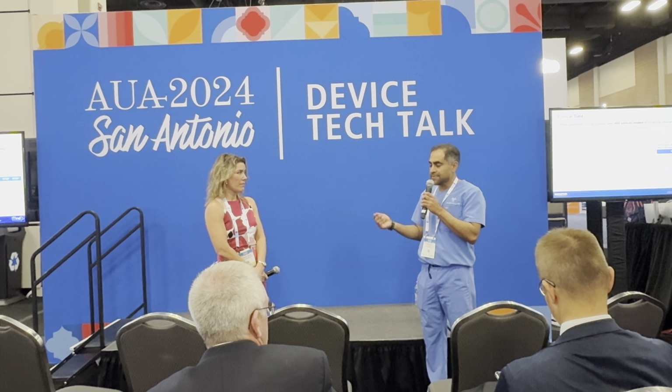Right. I would agree that the procedure has a fast learning curve. And the nice thing is there are very few issues afterwards. I place the patients on some antibiotics after the device has been removed. They get an antibiotic when we place the device. So you're not going to have anyone get hospitalized afterwards. I get an occasional patient who may have urinary retention. That's probably the worst thing that I've seen. And I place a catheter for a few days, depending on their volume. So the complication profile is very attractive.